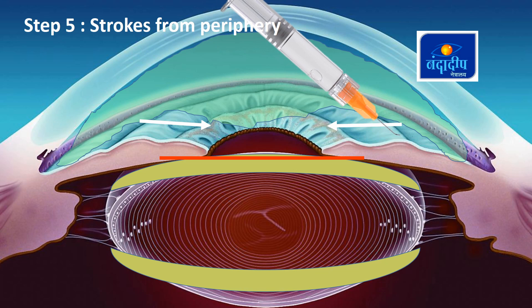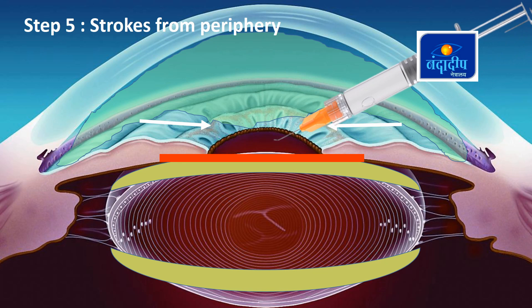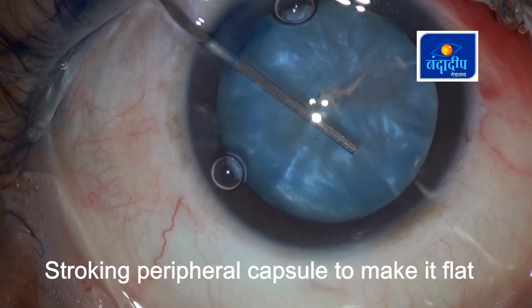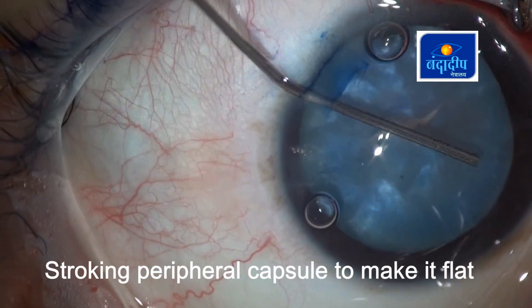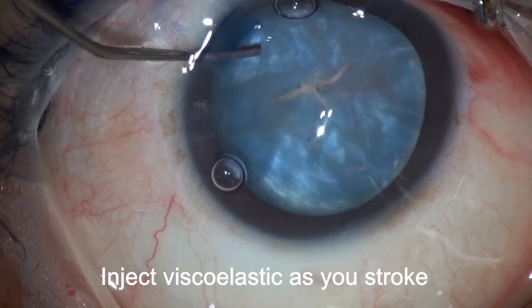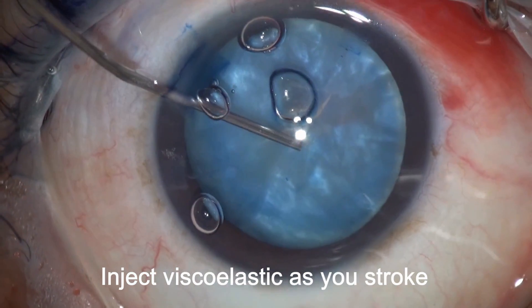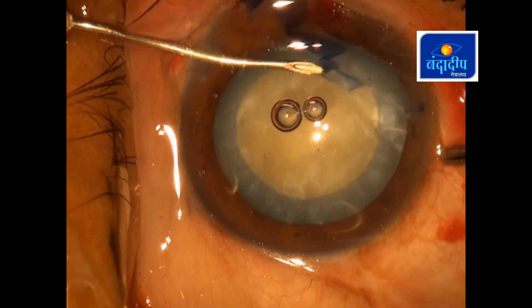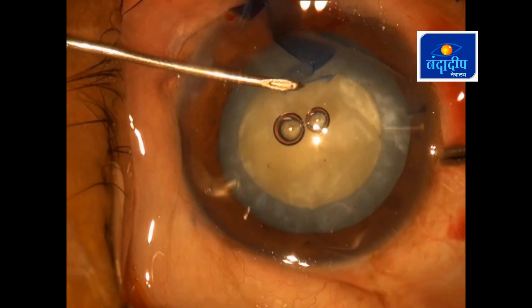Step 5: Strokes from the periphery. Despite taking out cortex from the anterior and posterior part of the lens, there are still fluid pockets left in the periphery which can cause radial extension. To remove these pockets, we gently nudge the peripheral capsule using a visco cannula, flattening it out. We also inject a little viscoelastic over these areas so that at the end of this step the anterior capsule is flat throughout. This is the tamed lens with no intumescence left. Now we can use a cystitome or microcapsulorhexis forceps through the side ports for closed chamber maneuvers.